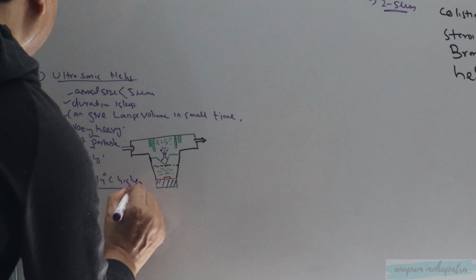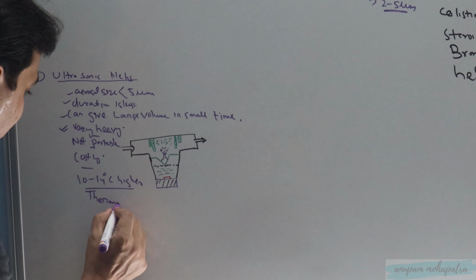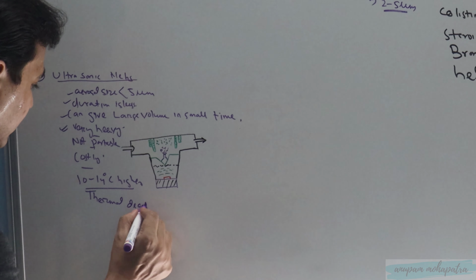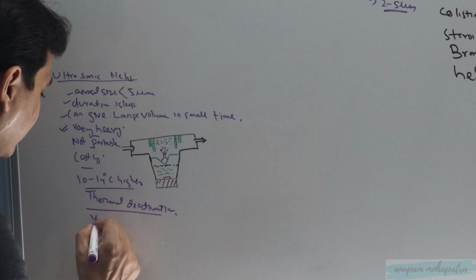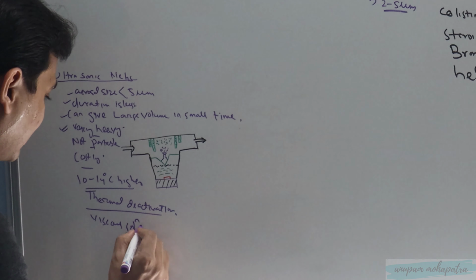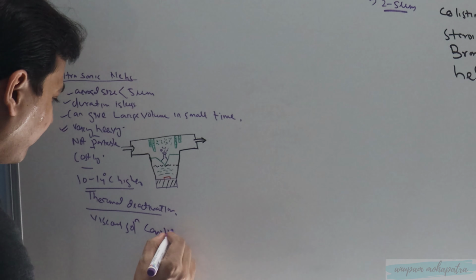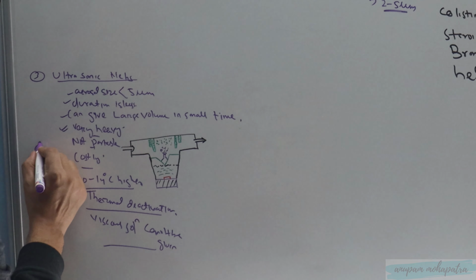So there can be thermal deactivation, and it is not suitable for viscous solution. Viscous solutions cannot be given. These are the disadvantages.